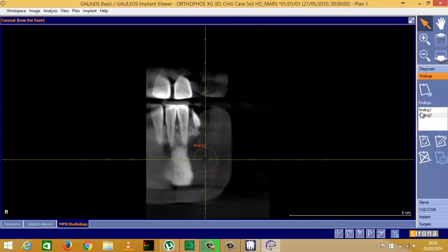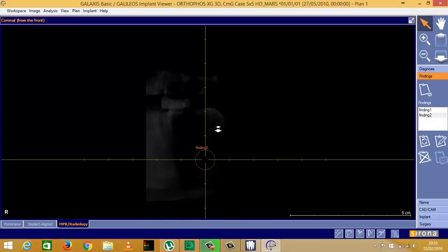Now you see I've got finding one and finding two in my list. I'm going to go back and carry on scrolling through by holding down my left mouse button, right to the bottom until I can't see anything anymore. Now I'm done with my reporting.